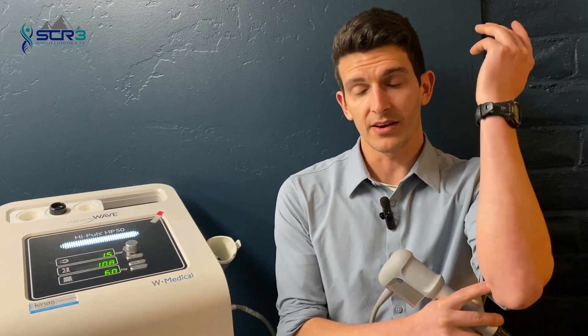Shockwave is a very easy, very nice treatment for a range and host of tendinopathies. For example, the inside of the elbow is a very common area that gets injured in rock climbers, golfers, and especially gripping-type athletes.